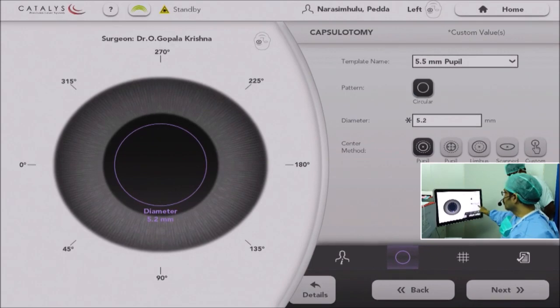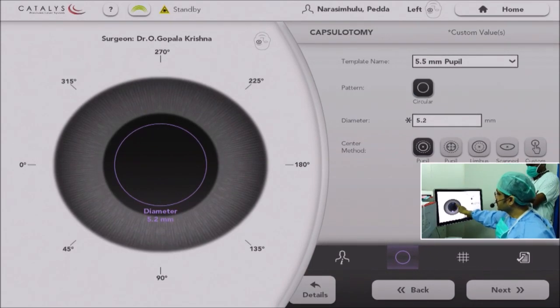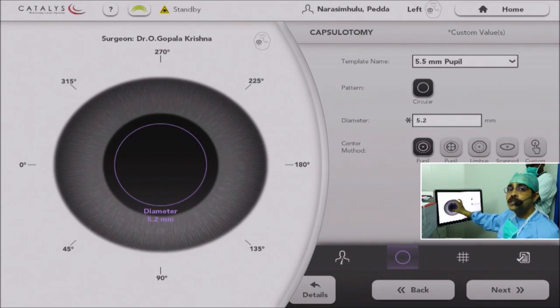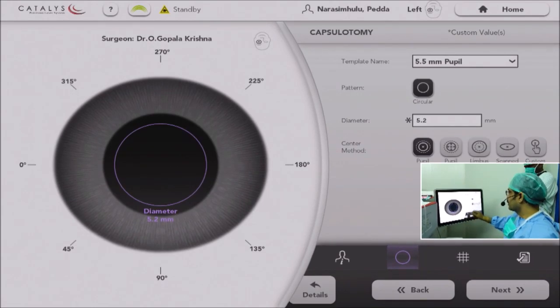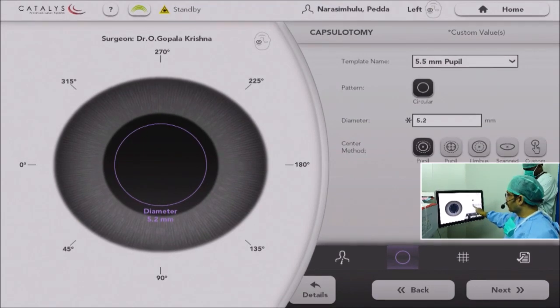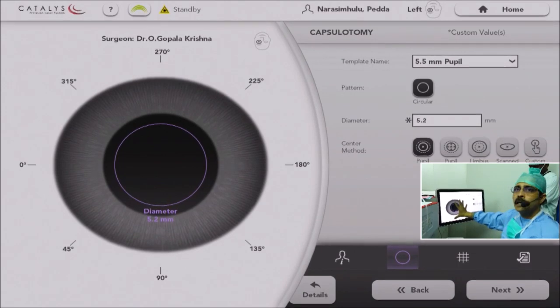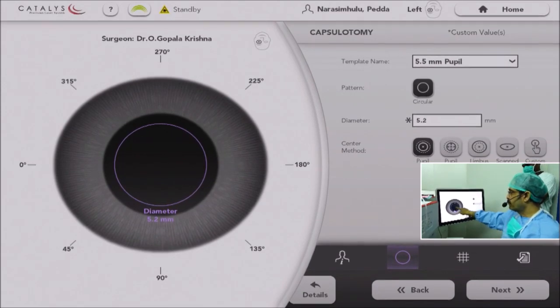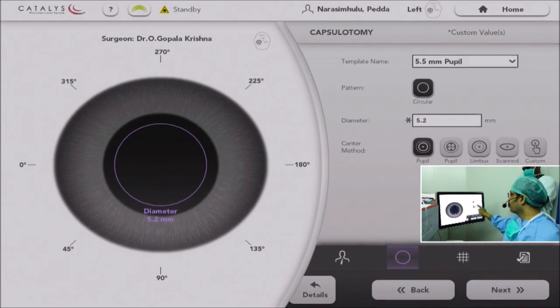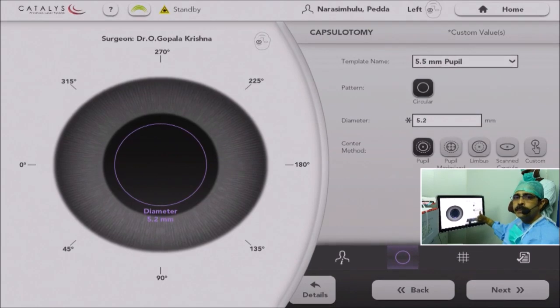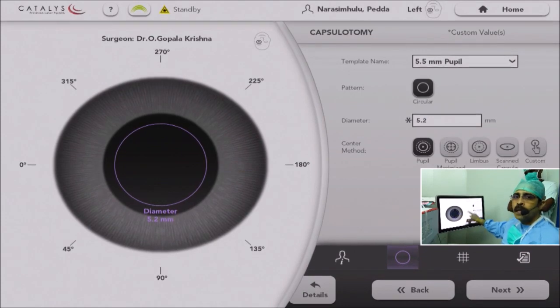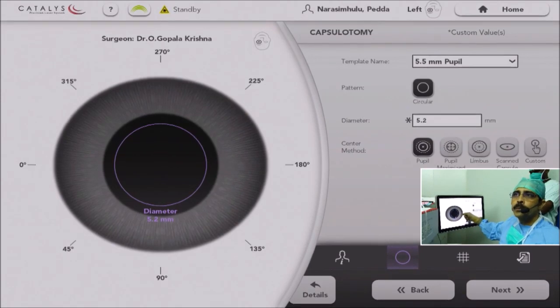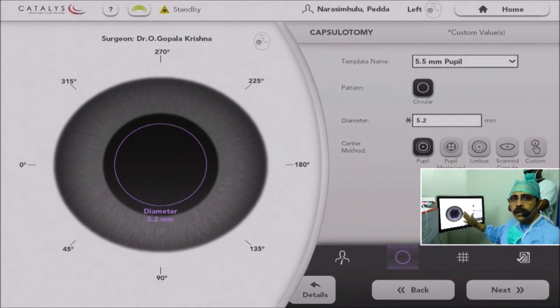Most surgeons prefer to use pupil maximized or regular pupil centric. Pupil maximized comes into play when the pupil is not appropriately dilated. Suppose I want to make a 5.2 or 5.5 mm capsulotomy diameter, but if the pupil itself is 5.5 mm, the system alerts me saying the pupil is 5.5 mm and I cannot do a 5.5 mm capsulotomy. Then we use pupil maximized, and the system gives you 1 mm less than whatever the pupil diameter is. So you can always titrate the capsulotomy size depending on the patient's pupil and condition.